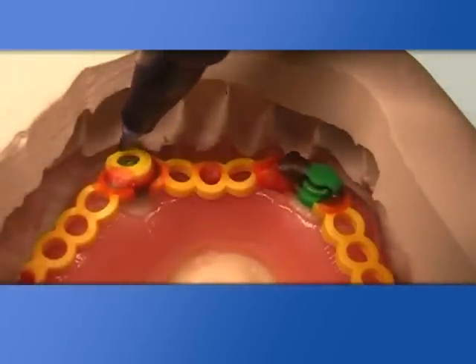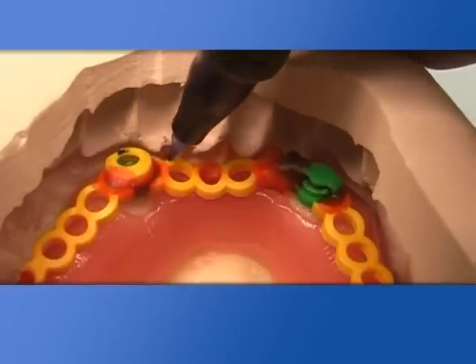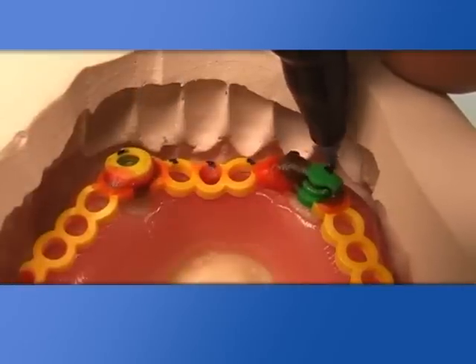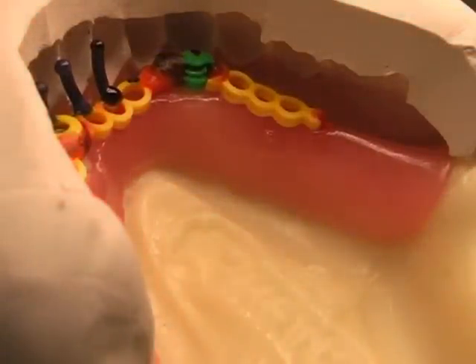Working on the master model, the trial mask always goes in position, allowing placement of reinforcement pins for the teeth. This reinforcement will strengthen the denture, avoiding tooth breakage.